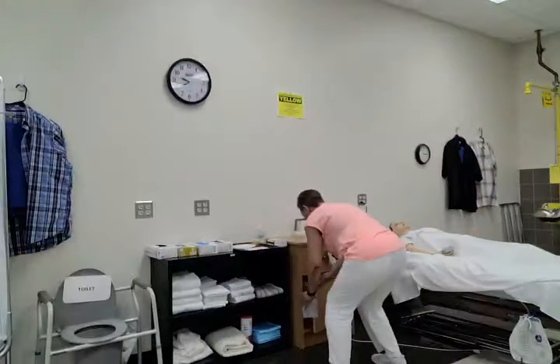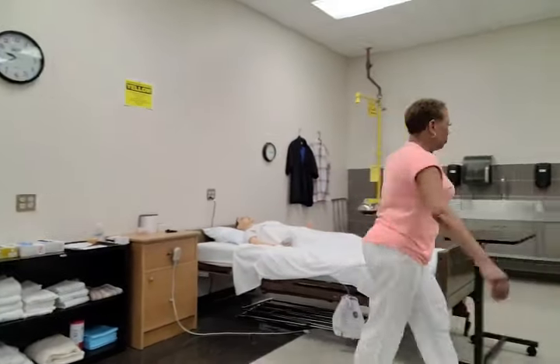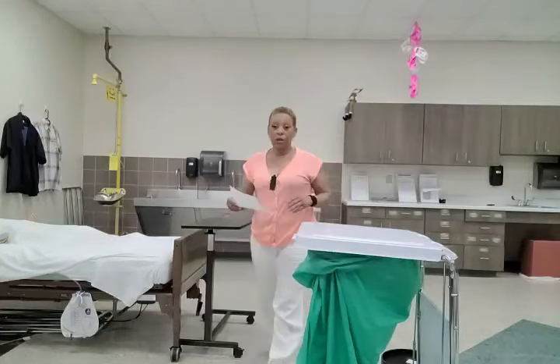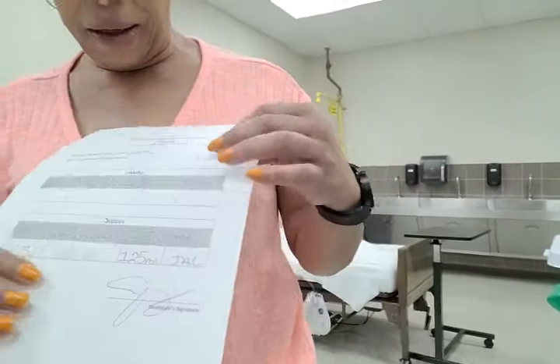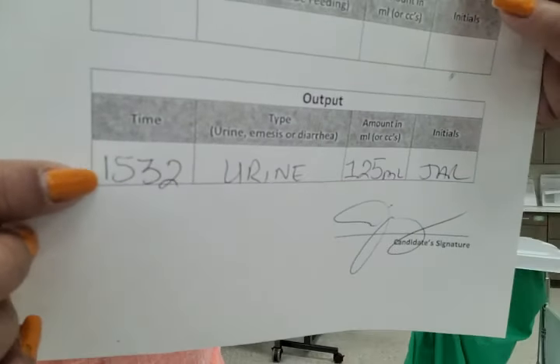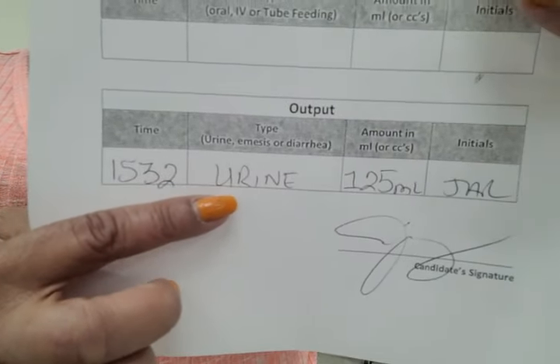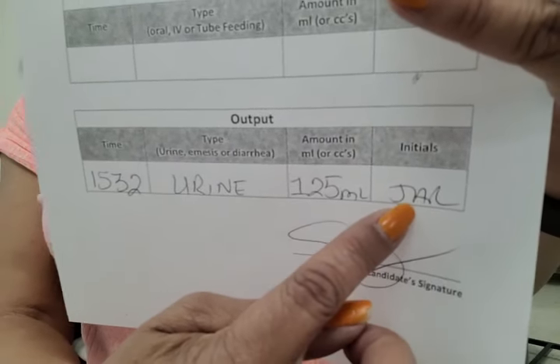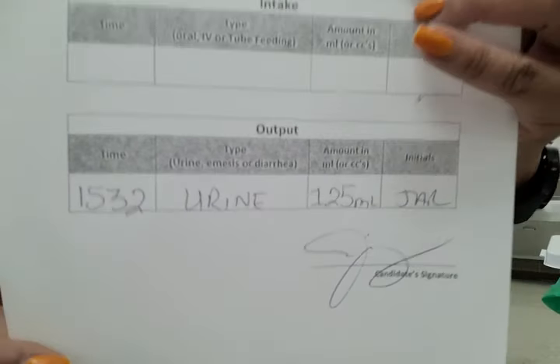Now I just want to show you a measurement sheet. During testing, this information will be filled out already. All you'll have to do is make sure you put the correct time, what type of output, the measurement, and your initials, and then you will need to sign. That was it — the Prometric testable skill: empties urinary drainage bag and measures and records urinary output.